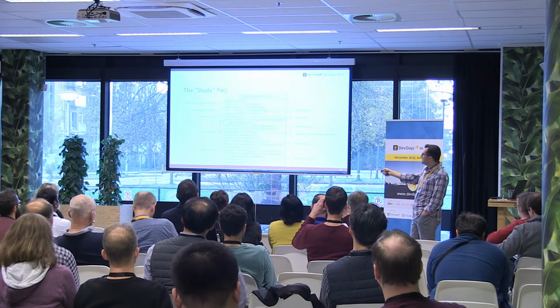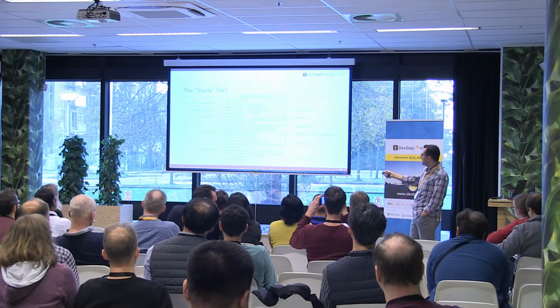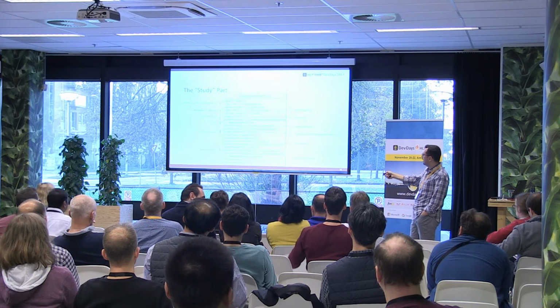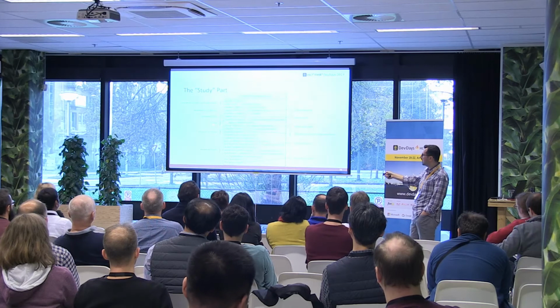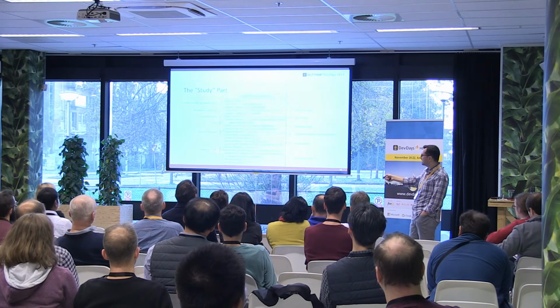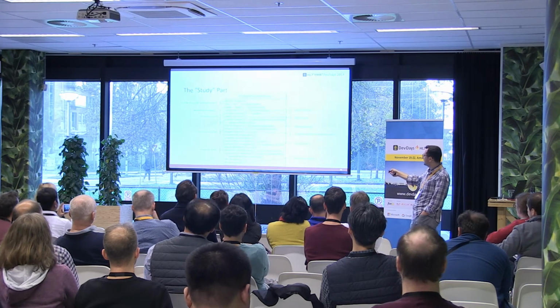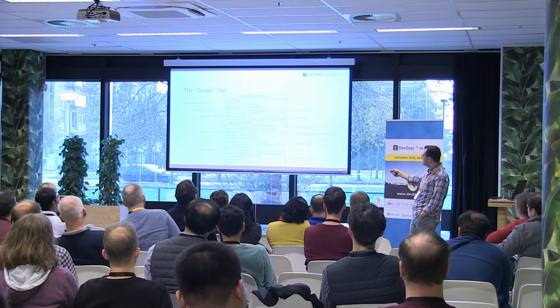It keeps track of the modality, as you can see right here. So CAT scan, MRI, etc. You can reference an encounter if there was one. You can reference your service request, which in DICOM speak is an order. Reading radiologist is the interpreter in here. There could be a reason for your exam. Of course, the subject is the patient, study date, the physician that requested the study.